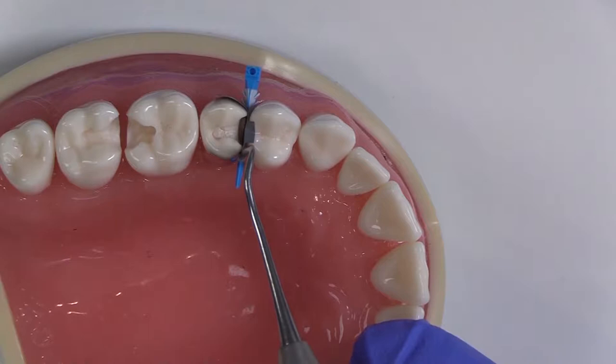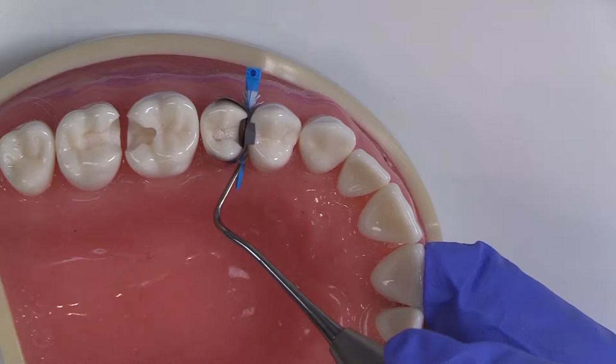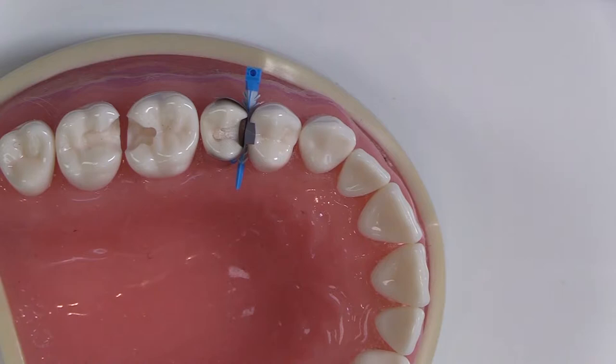I don't want to have a lot of extra flash as I come up the proximal, and if you use the shorter ring, you tend to have good adaptation but lose it as you come higher. I only use the short ring when there's difficulty with retention and the ring won't stay on. Otherwise, I always use the orange as my starting point.